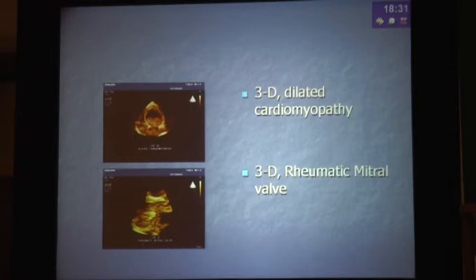It really hasn't taken off. It came around 7 to 8 years ago. It really hasn't taken off in cardiology circles. A little more cumbersome to do. Does not give as much information as we thought it would. 2D echo still remains the backbone of day-to-day practice. This can help in patients who require mitral valve repair or in rheumatic heart diseases and congenital heart diseases, but not routinely for our day-to-day cardiac practice. A little more cumbersome, time-consuming, and not really cost-effective.